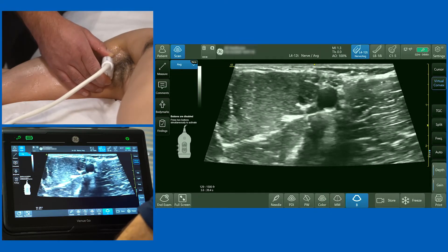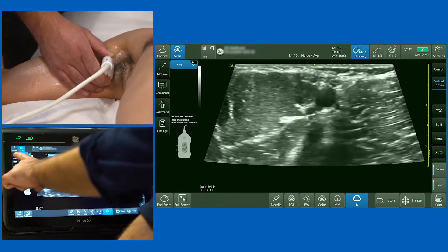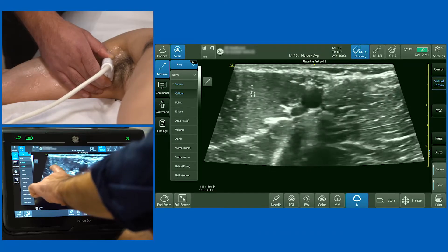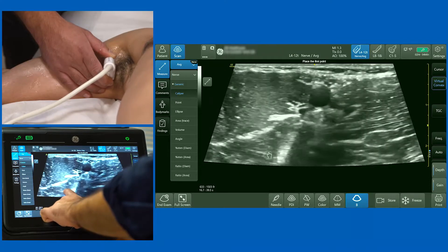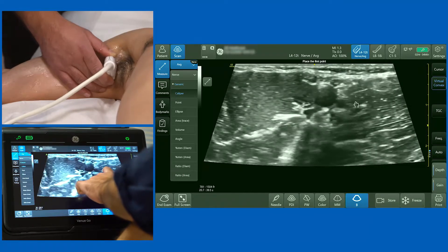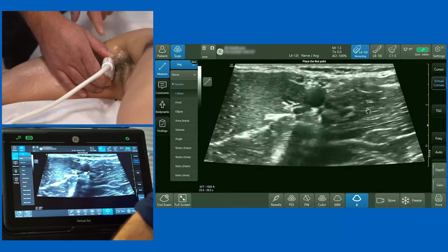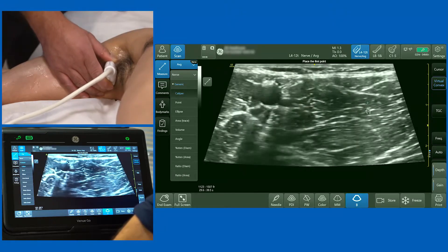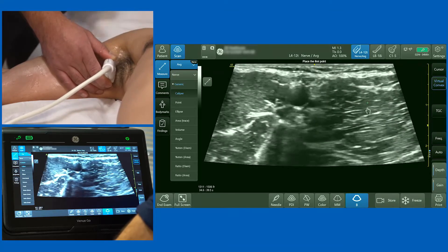Going back to standard scanning, I can identify a nice circular hypoechoic structure which is the axillary artery. To the left is the biceps brachii, and deep to it is the coracobrachialis. On the right-hand side is an amorphous mass of muscle. Many people place their probe where the radial nerve has already dived away and they're scanning over the triceps — this is not the correct position.